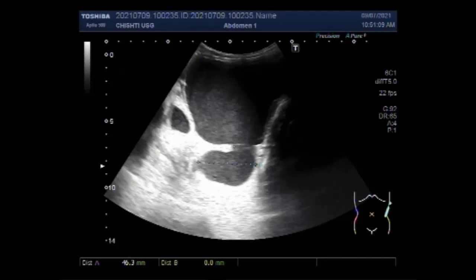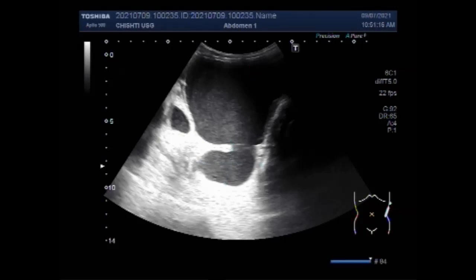Now you can see the communication between the urinary bladder and the diverticulum, along with the measurement of the bladder.